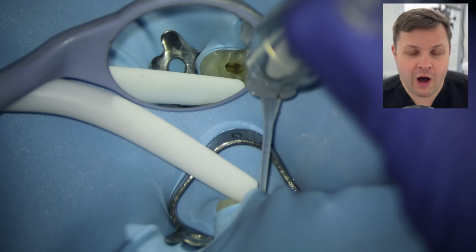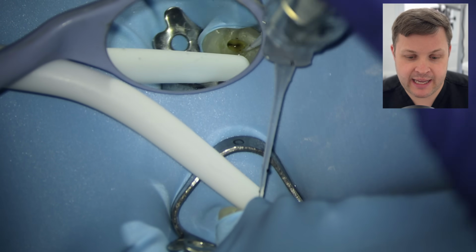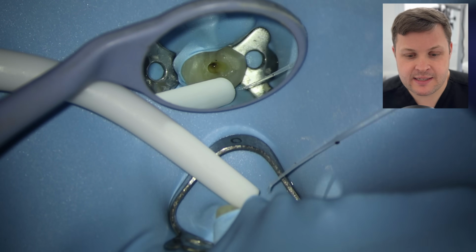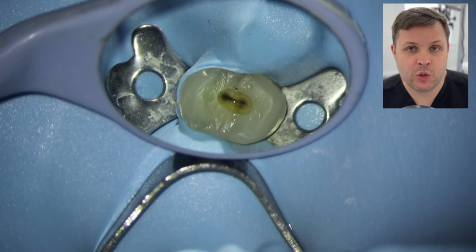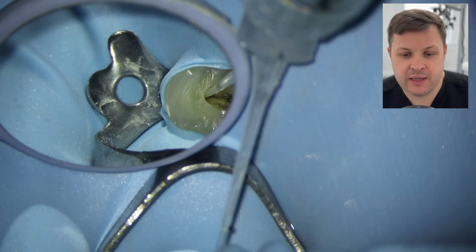But before I do the apex locator reading, I'm going to irrigate, and what I like to use are these Irriflex side venting tips. They side vent, as you can see here, but also because they're quite flexible, they get right down into the canal space. So we give it a good old irrigation there.